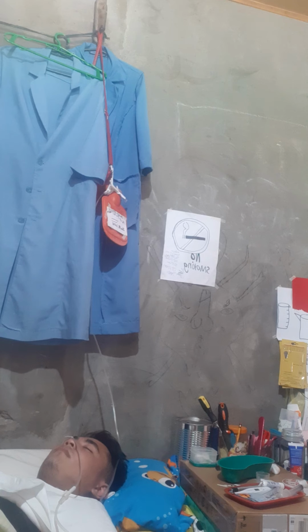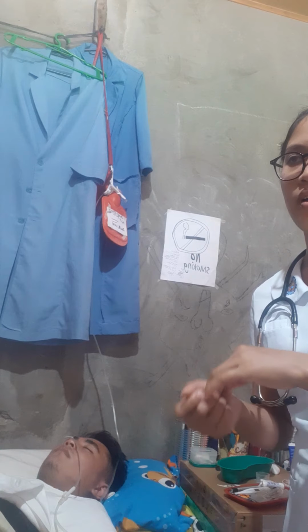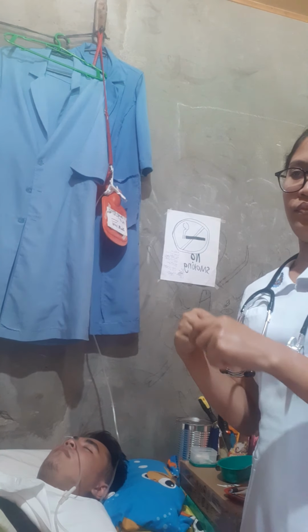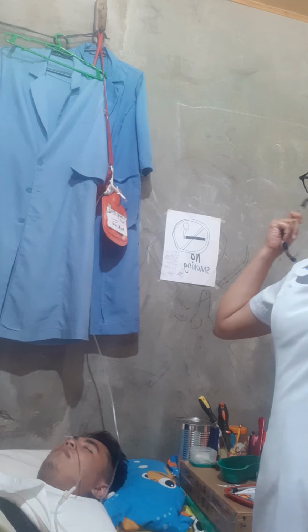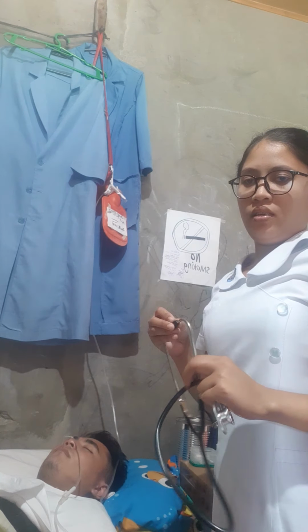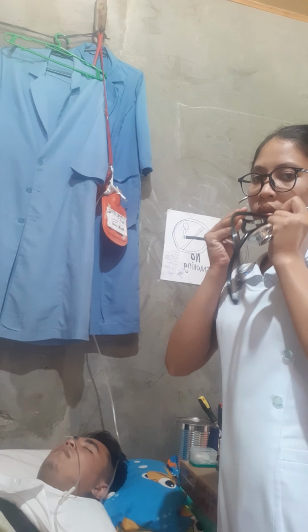After washing hands, for evaluation, perform a follow-up examination of the following: tolerance of feeding, bowel sounds. For tolerance of feeding, check if the client feels nausea or cramping.